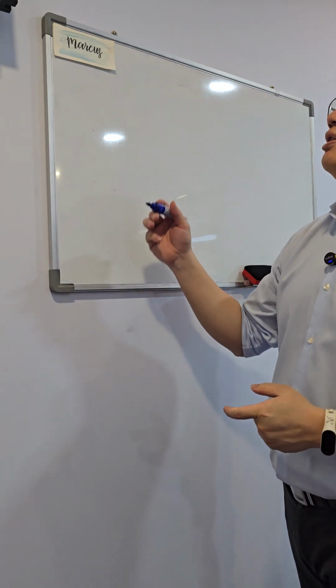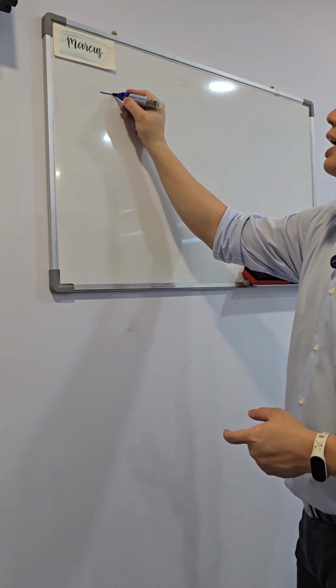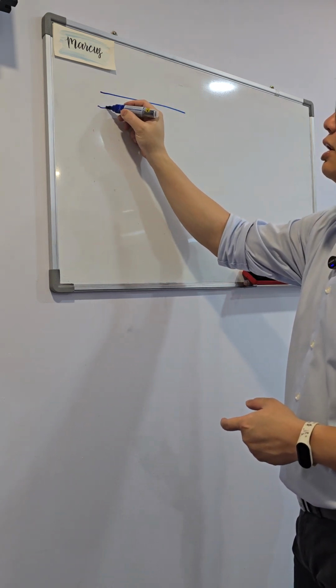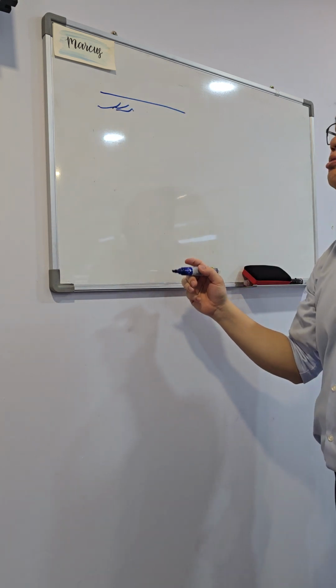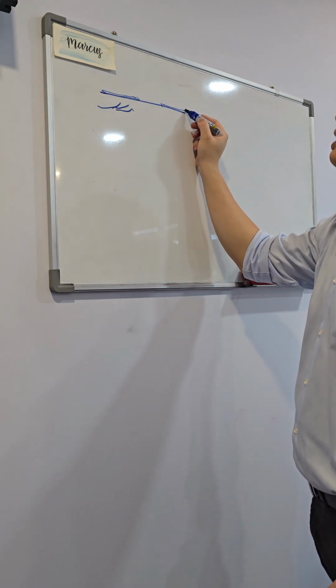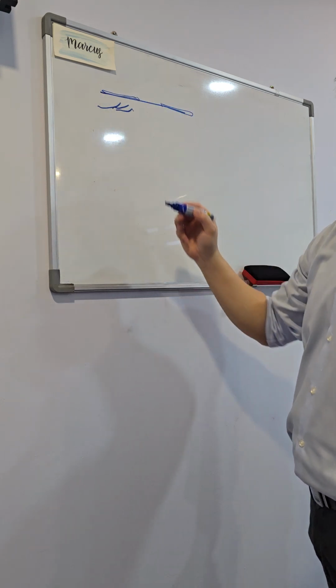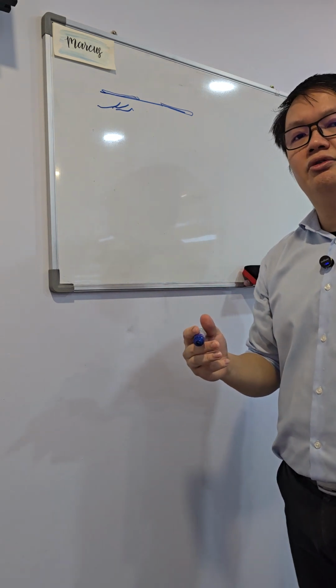So TENS is very superficial, and what we end up working on is the skin layer, where there are a lot of nerve endings. Okay, and we are stimulating it using a patch, usually over the area of pain, somatic referral areas.